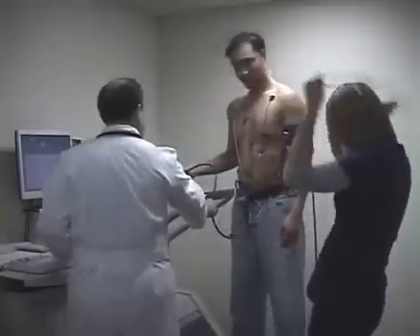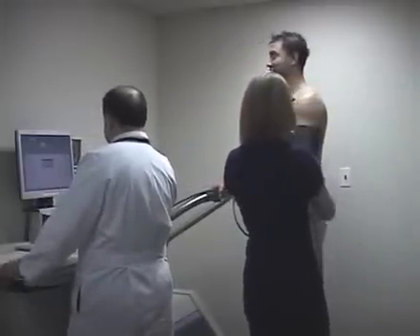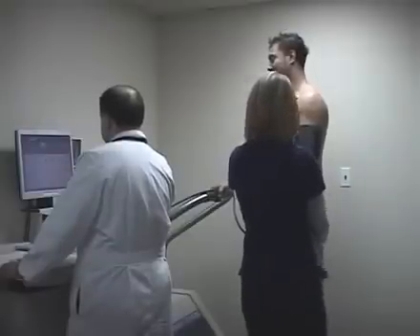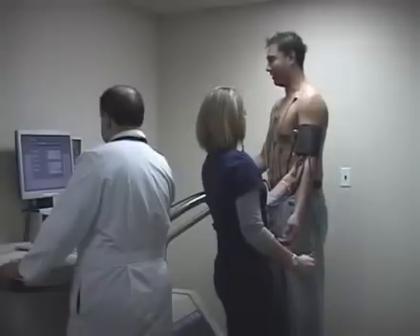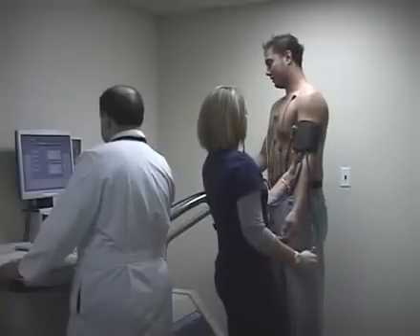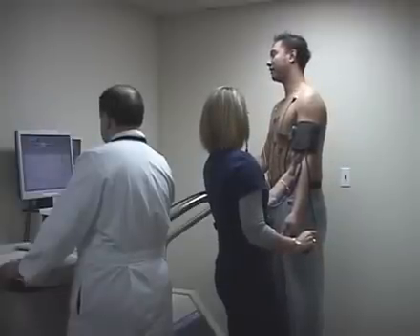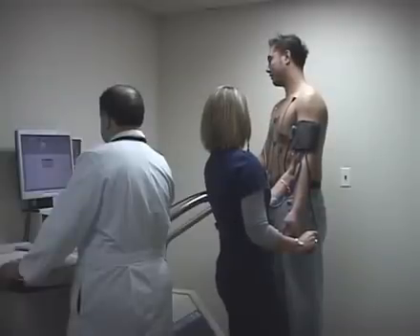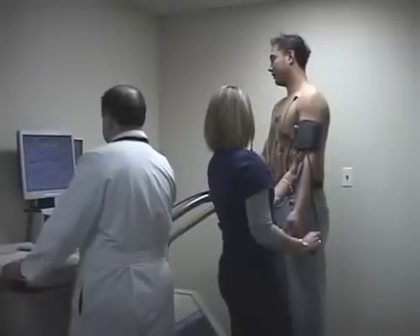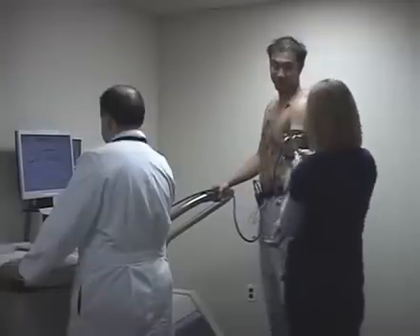We call this radiation-free stress testing because we don't give any radiation to the patient to look for blockage. We use ultrasound, which is radiation free, to find out if there is any significant blockage in the heart. This is a much better test because we don't inject anyone with radioactive material that could potentially increase the risk of cancer, and we also get a lot more information than a typical regular treadmill stress test or even a nuclear stress test would show.